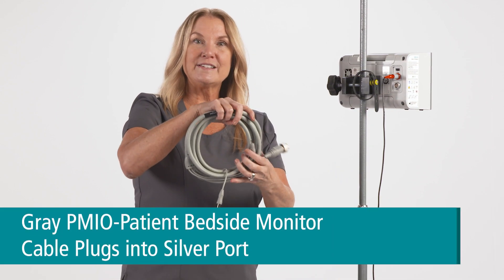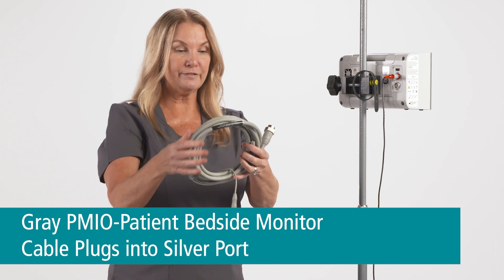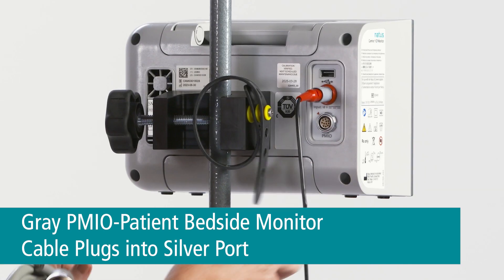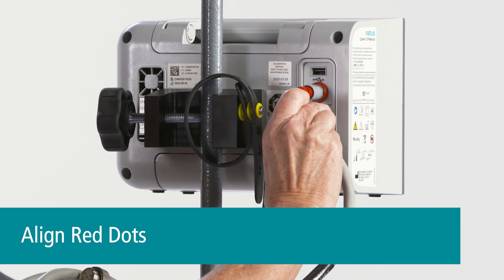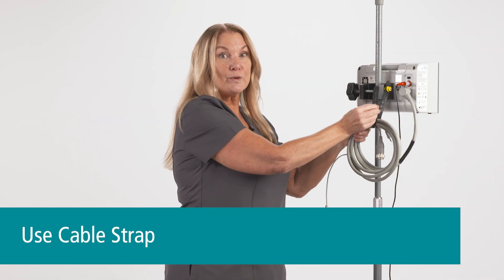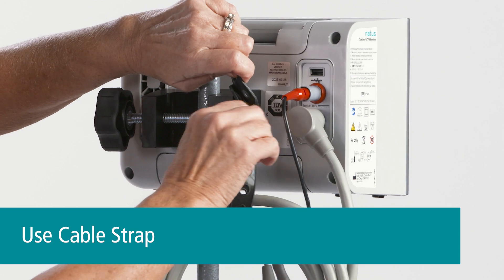The gray cable is the PMIO cable and it has a silver attachment. It's going to plug into the silver port — just align the red dot with the arrow and push. The cable can be easily organized using the strap on the back; it just buttons into place.